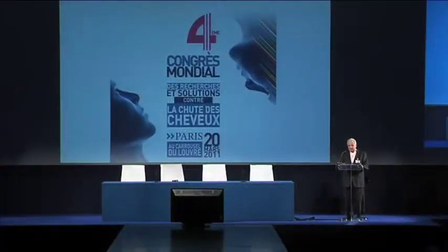So now you are going to discover an entirely new examination table. This is the latest generation diagnostic tool. This examination tool will allow dermatologists and capillary experts to carry out a whole battery of tests which will lead to an identity card of the scalp and hair.